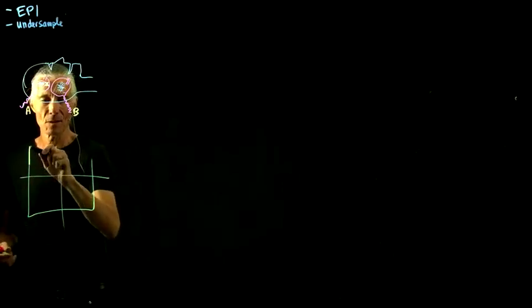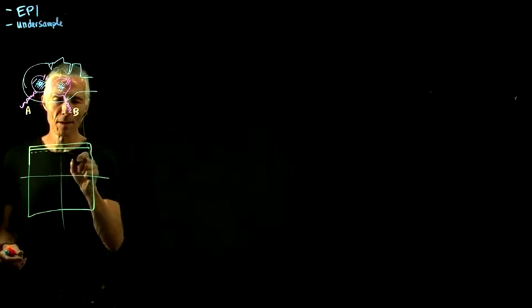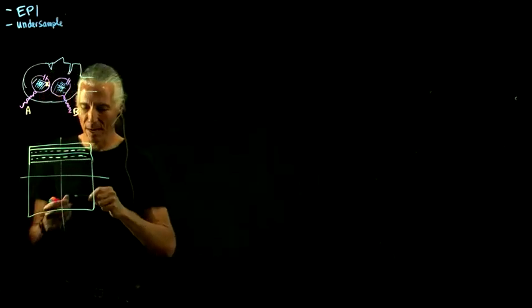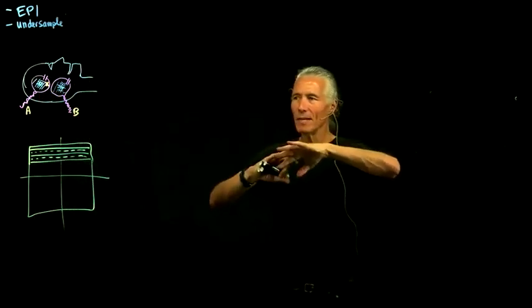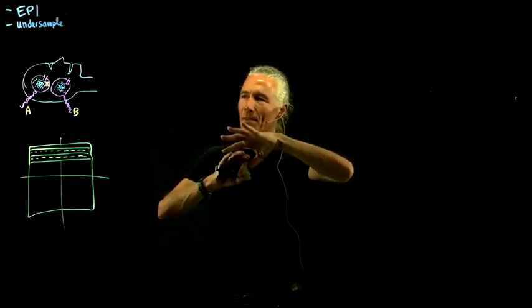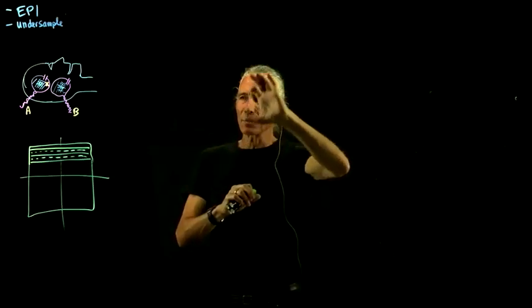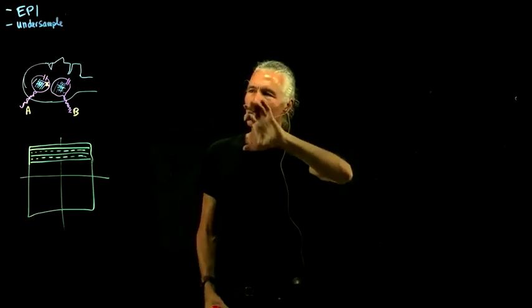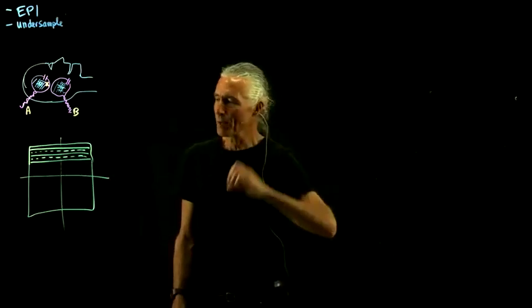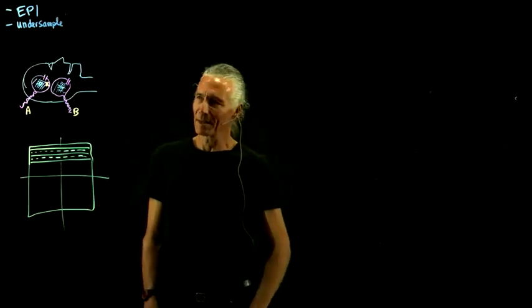So start with a Fourier transform of a brain, and then leave that line, take out this one, leave that line, take out this one. What happens if you do that is you'll immediately have the field of view issue. You'll get these ghosts that move down by half of the field of view. So it looks like you got another copy of the brain displaced on top of your actual copy by half of the field of view. Obviously that's not going to work. You just can't leave it out.